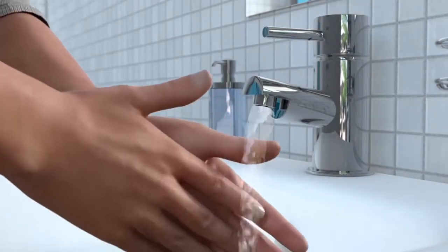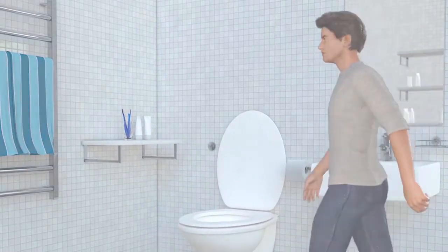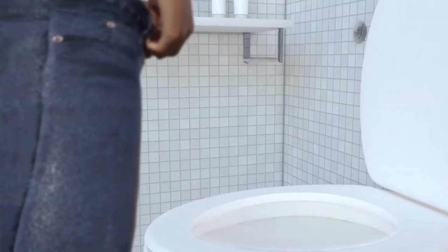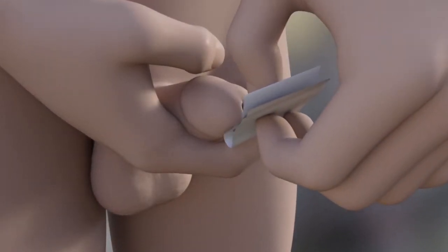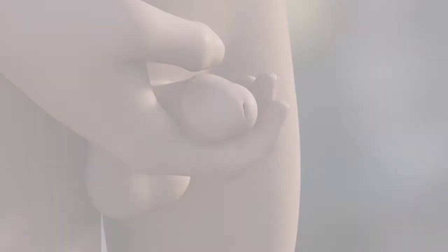Before you start, remember to wash your hands thoroughly. This is important because it can help reduce infections. Now it's time to get into the position you find most comfortable. Stand in front of the toilet, pull down your pants and stand comfortably. Gently pull back your foreskin and clean your penis, especially around the entrance to your urethra. You can use soap and water or an antiseptic wipe.